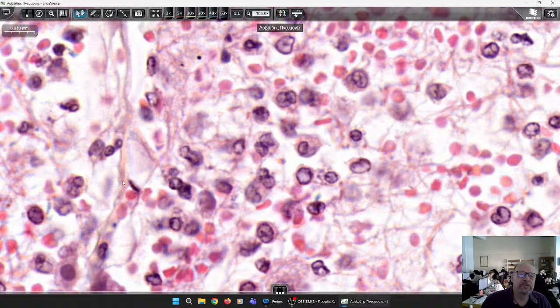What is the difference? Have a look at this one. It's very typical. And the neighboring cell. How do they differ morphologically? Yes, please. One has a multilobulated nucleus and the other a round nucleus. So we have neutrophils, polymorphonuclear, and we have the mononuclear, known as macrophage.